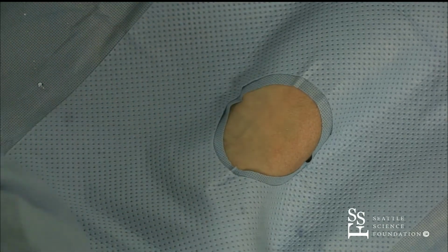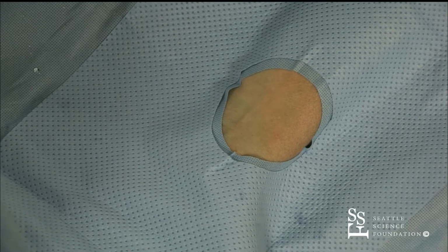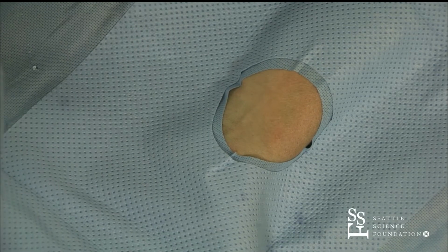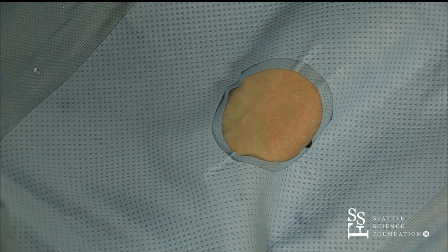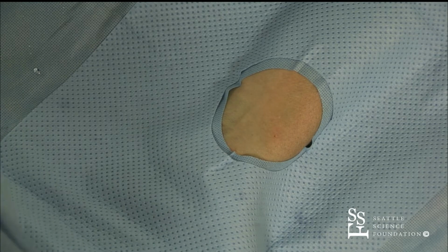Good. So we tend to make a wheal and then massage it a little bit and get the volume to go away so it doesn't get in the way of you hitting the artery. All right. Get my gloves on appropriately.